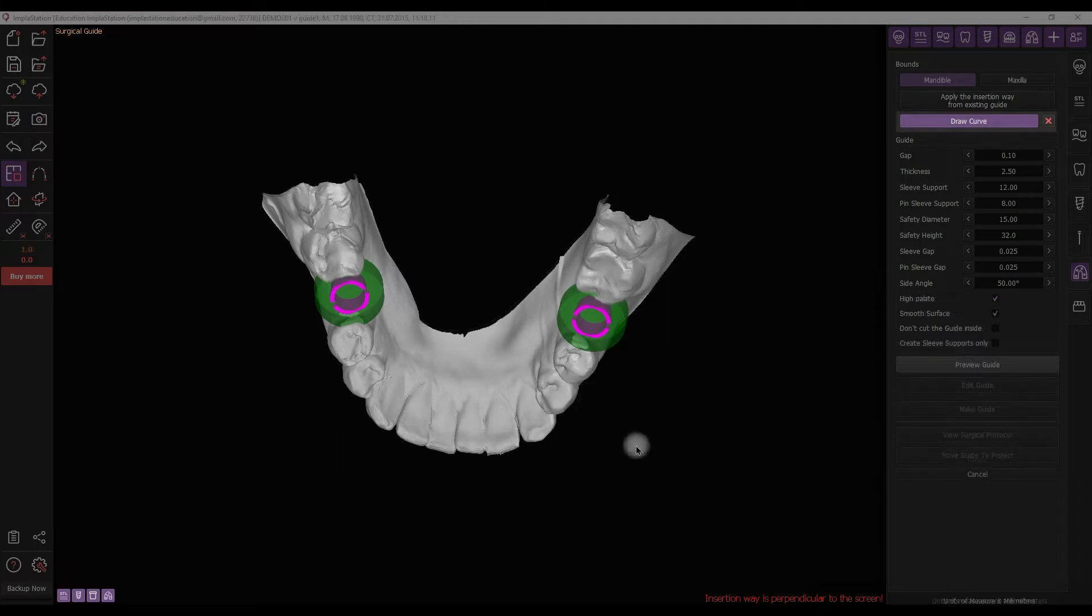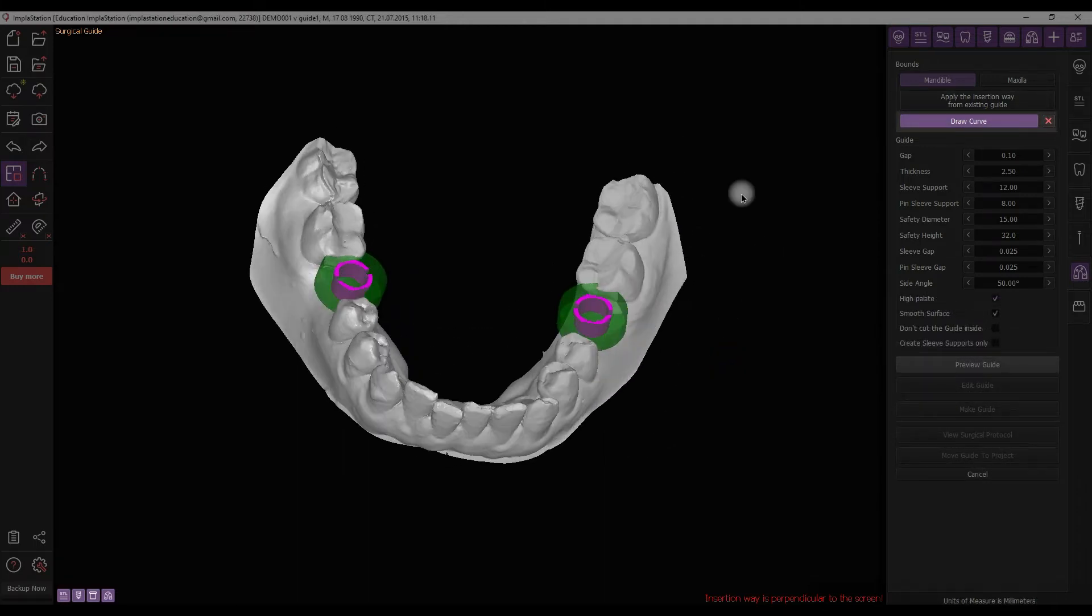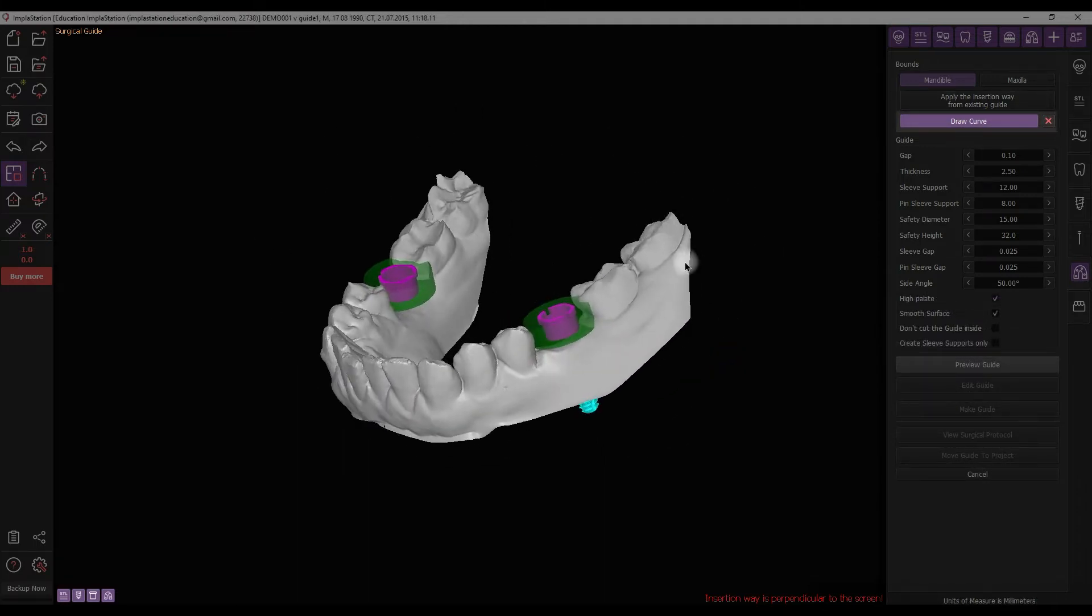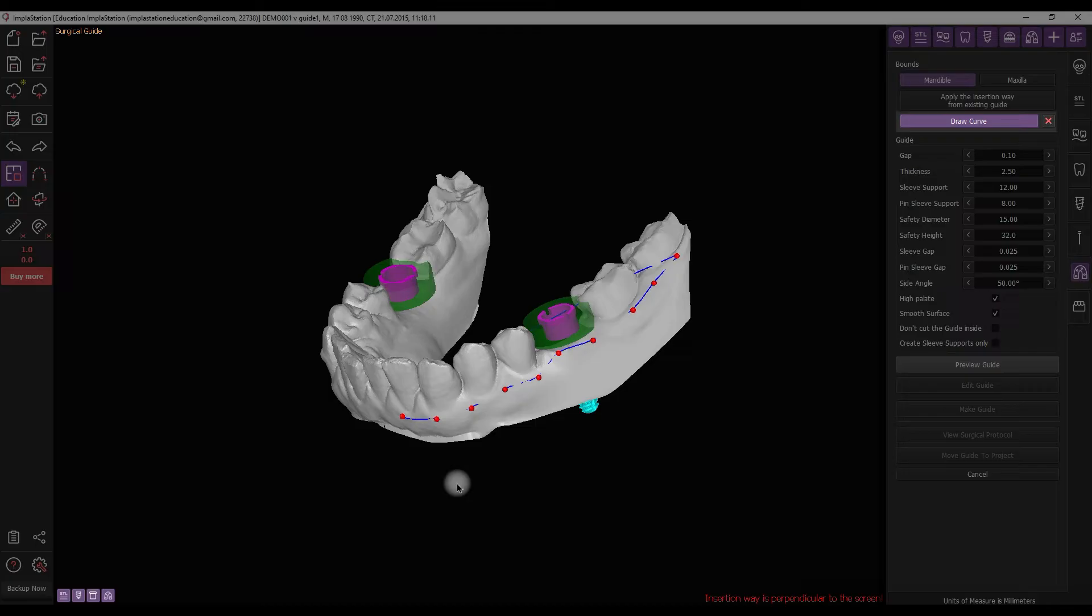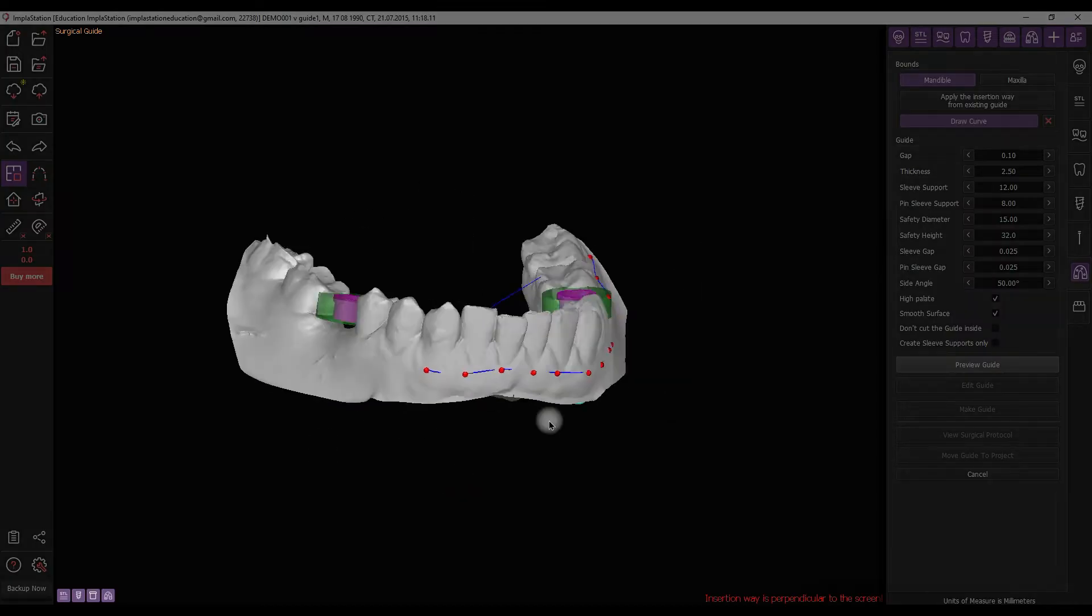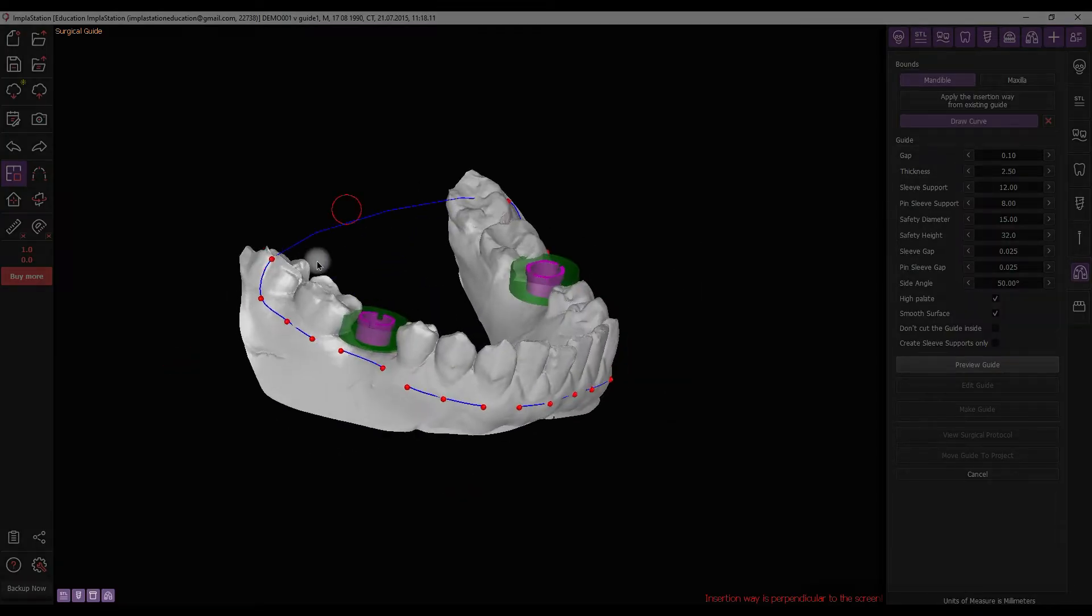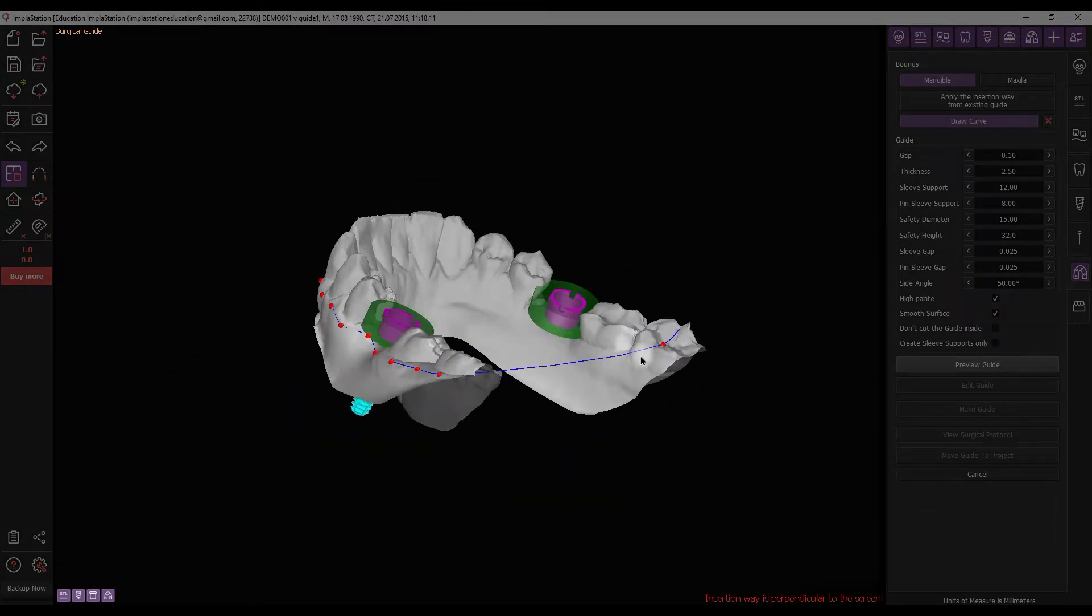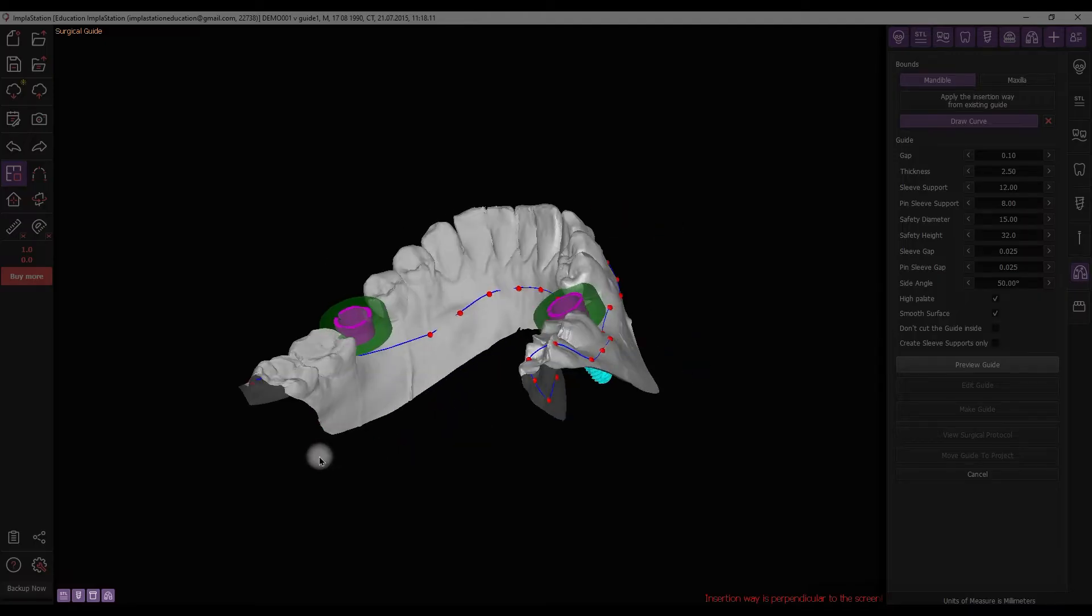The next step is to set the contour of the future guide by drawing a curve on the STL surface. Position the object as accurately as possible, set points on the surface to draw the curve, move the points to edit the curve, and complete the process with a double-click.